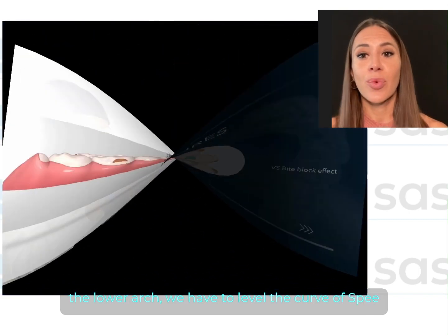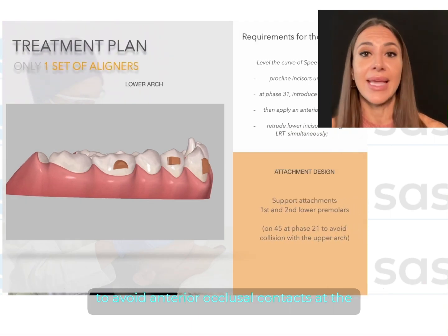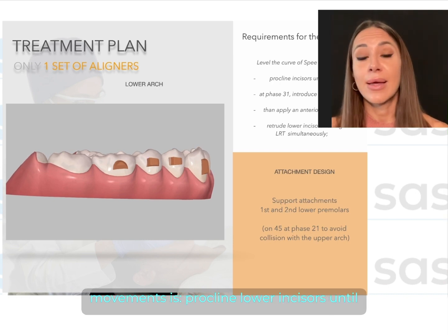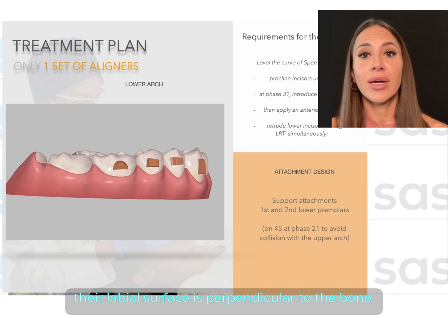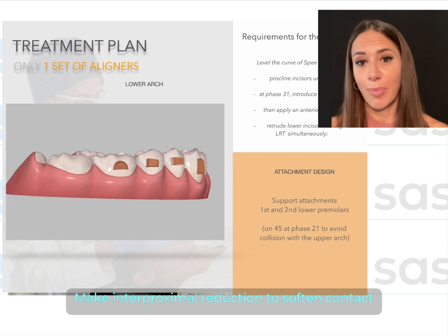In the lower arch, we have to level the curve of Spee to avoid anterior occlusal contacts at the end of the treatment. The right sequence of movements is procline lower incisors until the labial surface is perpendicular to the bone. Make interproximal reduction to soften contact points.